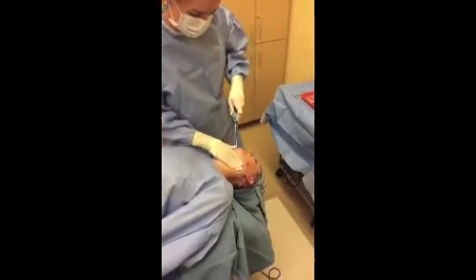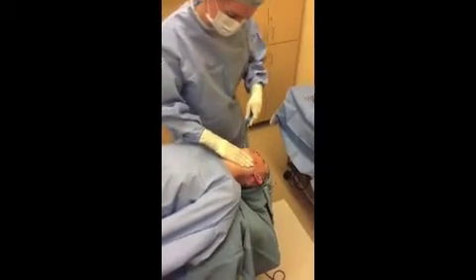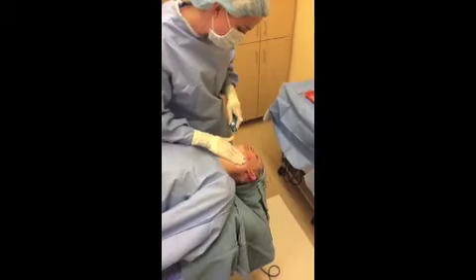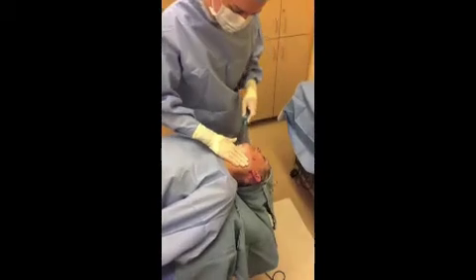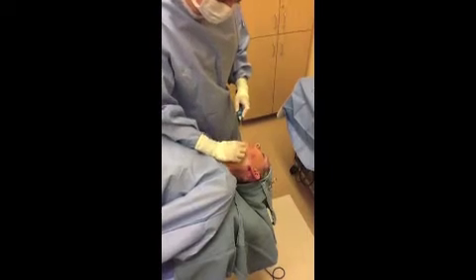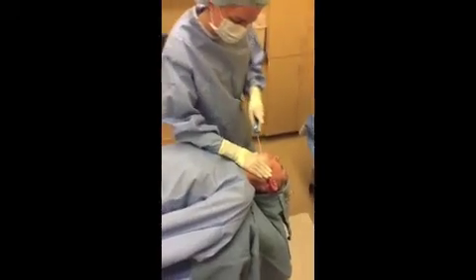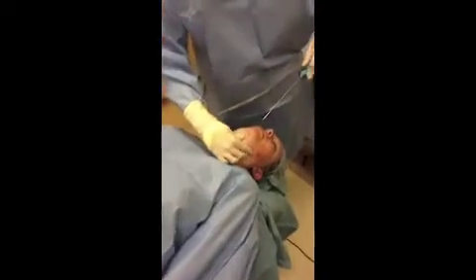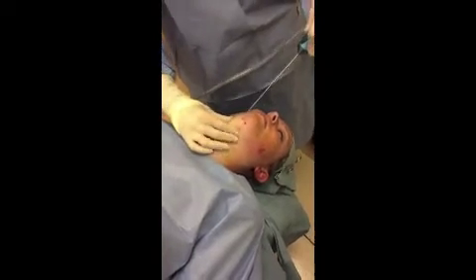You can see already that she's getting real flat on this side. Mary, you've got one of those little veins too that comes up here. I know. We have to see how that sclerotherapy went, and then we do yours. Now I'm going to switch over to the other side, to the other little port here. You can see, squeezing that compared to squeezing this, how little fat there is over there compared to this side.